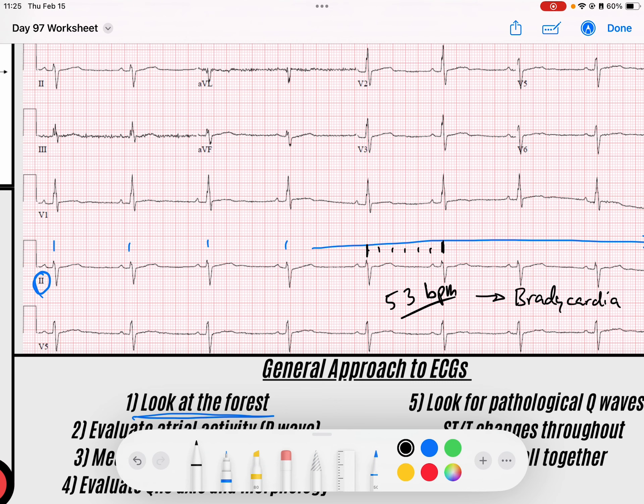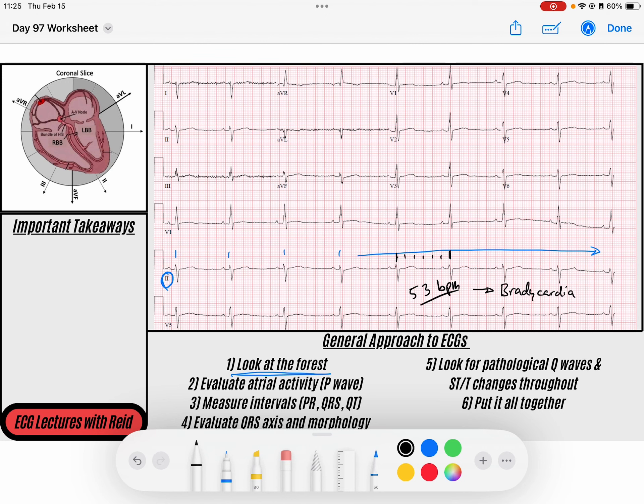We know our differential for a narrow complex bradycardia is it could be a junctional rhythm, it could be a sinus bradycardia, it could be ectopic atrial bradycardia. And I notice here as I just looked through that we have P waves before my QRSs. Let's evaluate those P waves, let's evaluate how the atria are depolarizing.